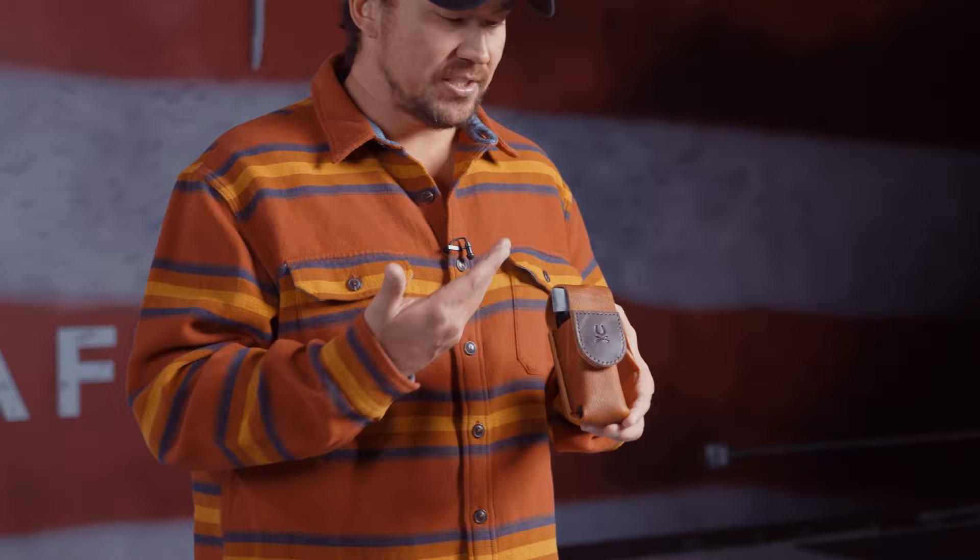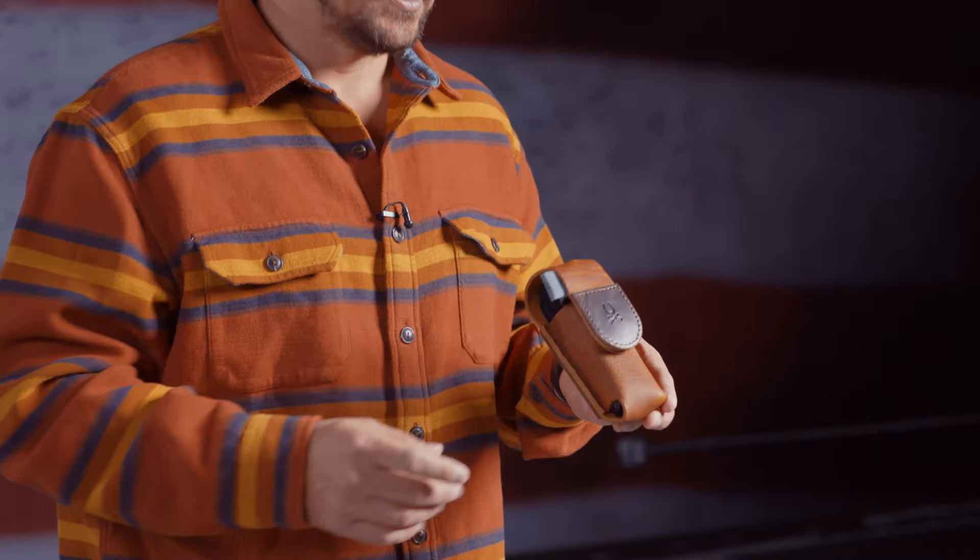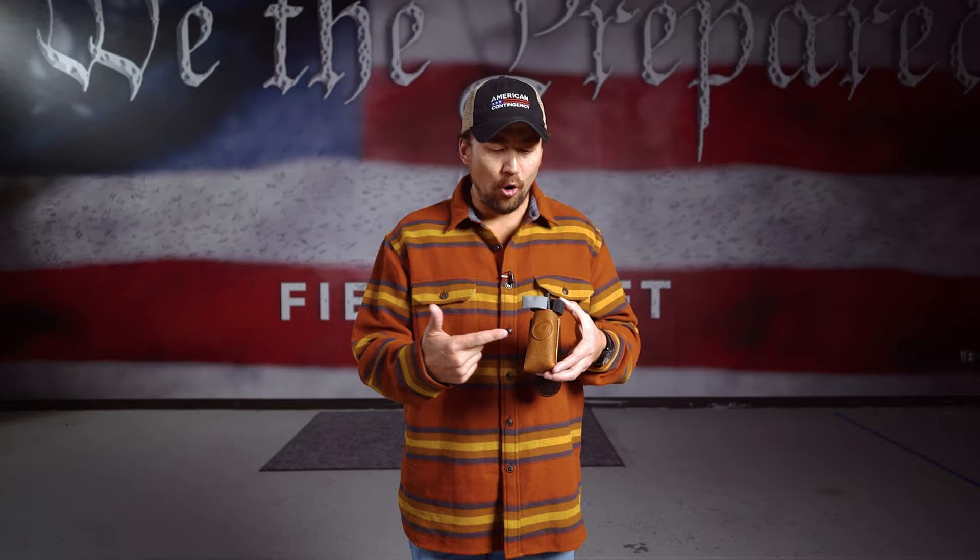So let's talk about the tourniquet. First and foremost, this is Fieldcraft Frontier — one of my companies. American-made, made-in-the-USA leather line TQ holder. The reason I would make something like this is because if you're a rancher, a farmer, or an EDC kind of person, you might carry this because it's more convenient than sticking an uncomfortable tourniquet in your pocket. You're less likely to carry something life-saving if it's not convenient and comfortable. I kind of cater to that because I want you to carry it. If you stick it in your pocket and you're like, 'this is uncomfortable, not going to carry that,' well then it defeats the purpose. So we have holders that carry this tourniquet comfortably and conveniently.